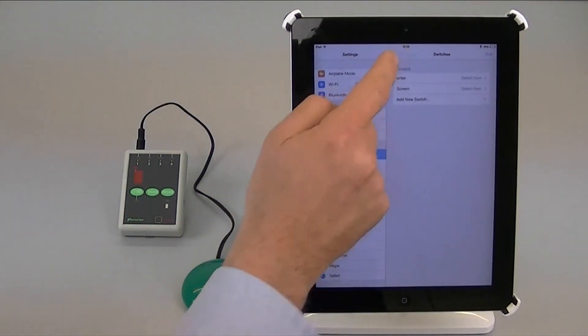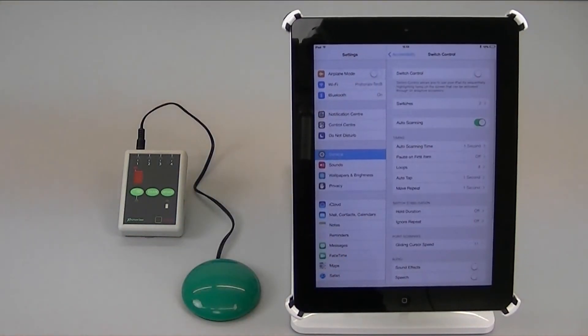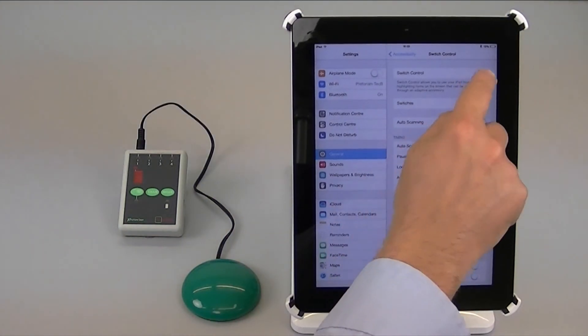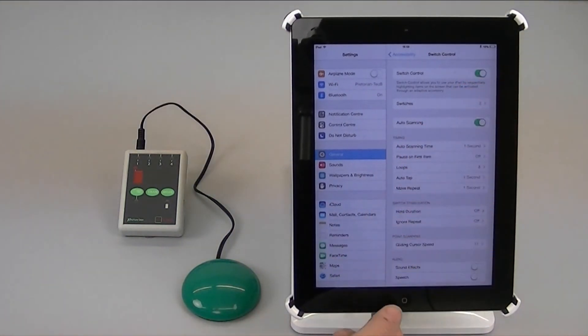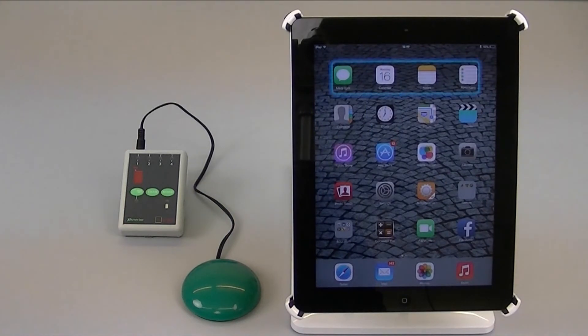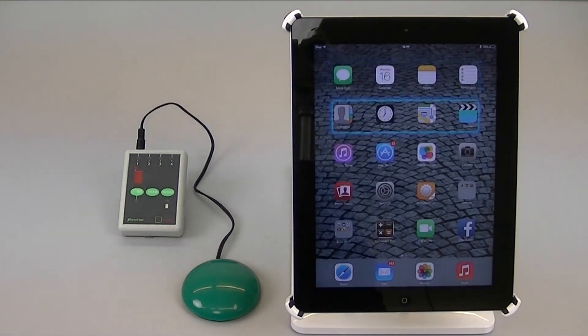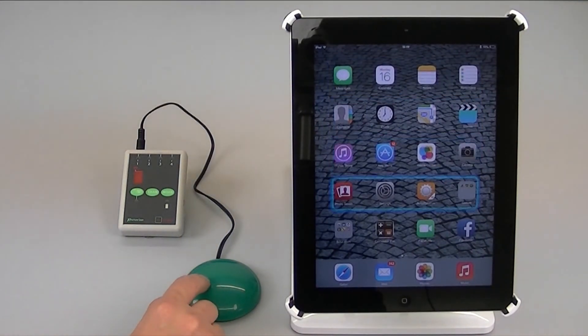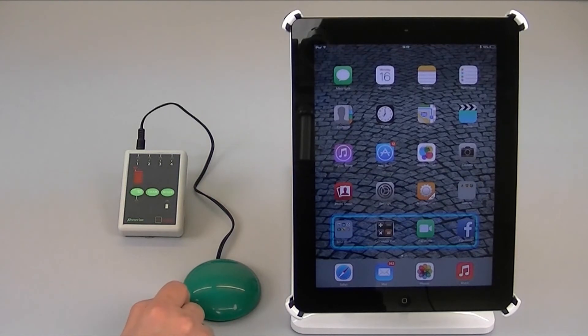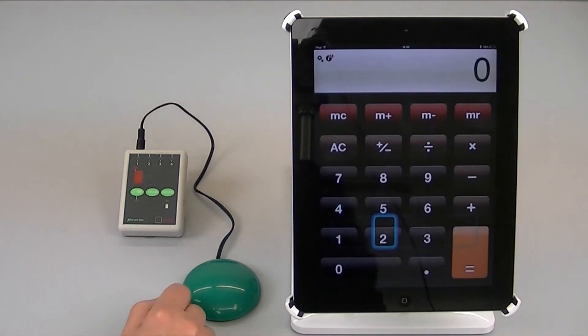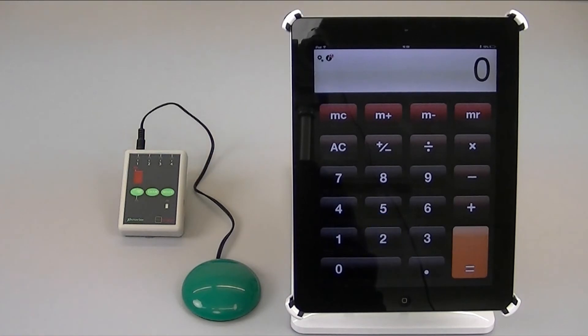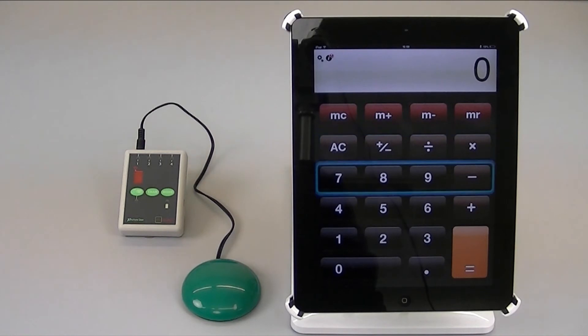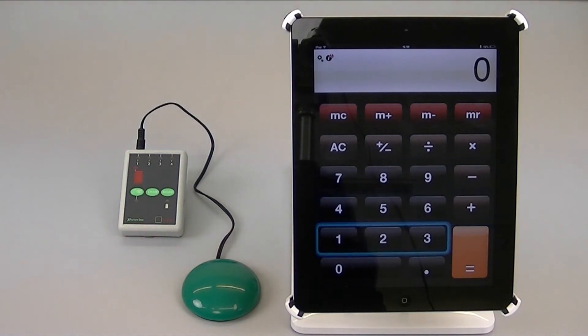If I now go back to switch control, auto scanning is already on and I'm going to turn on switch control now and I'm going to go back to the home screen and let's navigate to the calculator as usual. You see so long as I'm scanning and just pressing briefly, it works exactly the same as the auto scanning modes which I've shown you in previous videos.